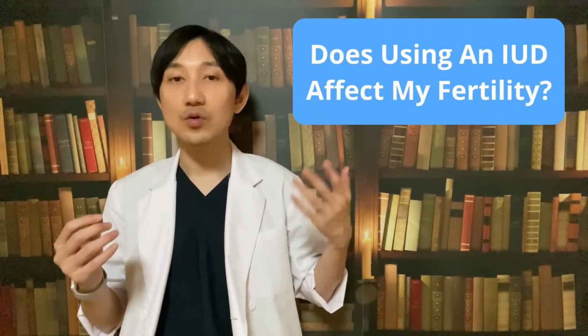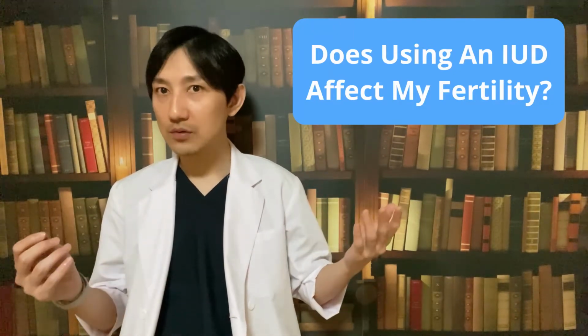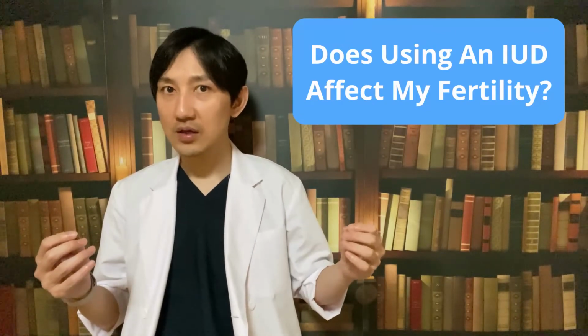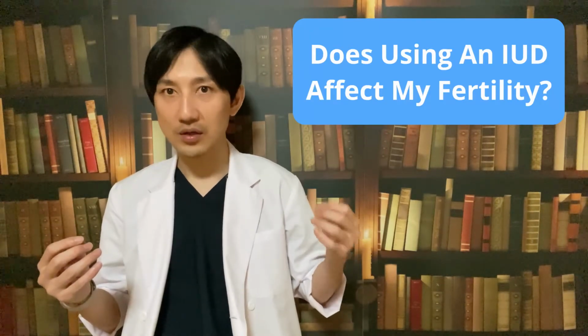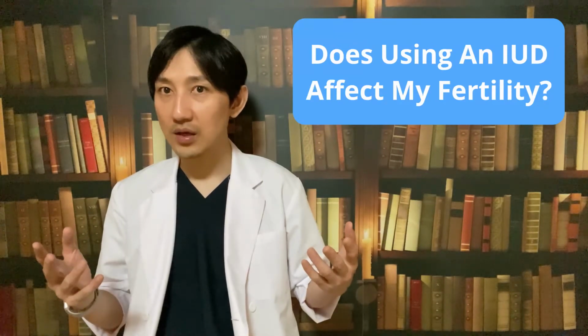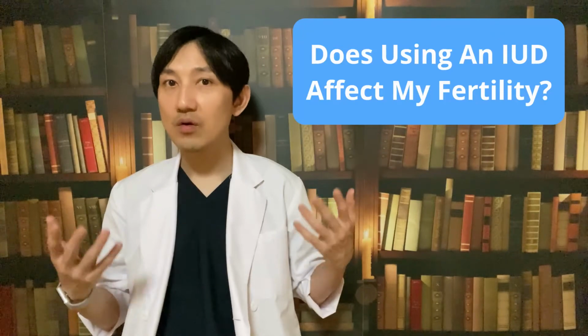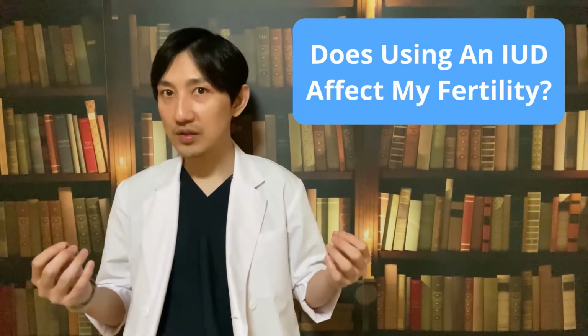You may wonder, does using an IUD affect your fertility? My answer is no. As soon as it is taken out, you are as fertile as you were before you started using it. Your periods will return to normal, and if you don't want to get pregnant, you must start using another type of contraception immediately. If you do want to get pregnant, you should follow all the usual pre-pregnancy recommendations, like taking folic acid supplements, eating healthily, and not smoking.